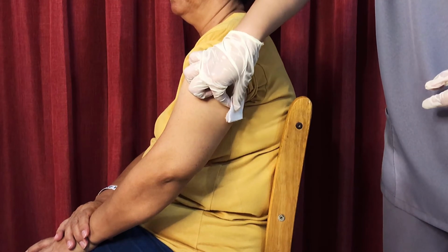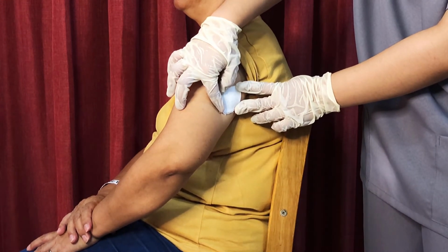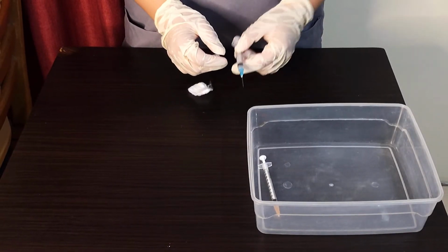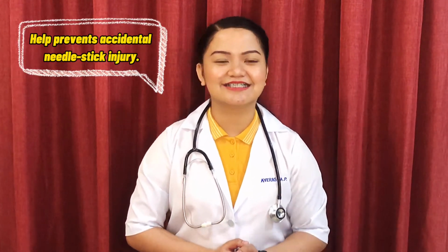Using a sterile gauze, apply gentle pressure at the site after the needle is withdrawn. Do not massage the site, okay? Massage is not necessary and can damage underlying tissue. Massaging after a heparin injection can contribute to a formation of a hematoma. And then, discard the syringe and needle into appropriate receptacle. Safety shields and needle guards help prevent accidental needle stick injury.